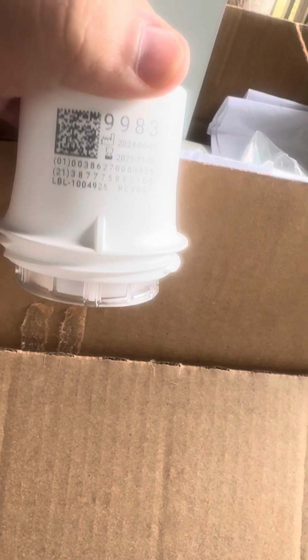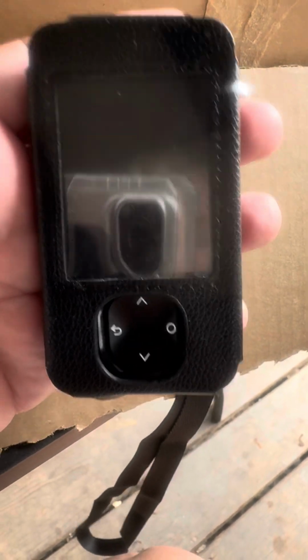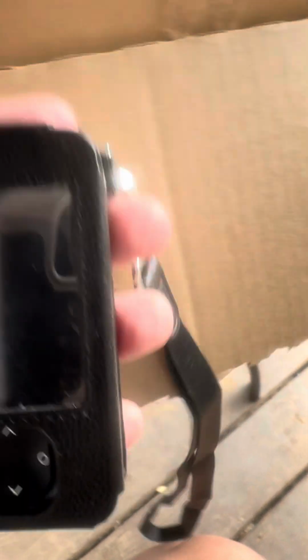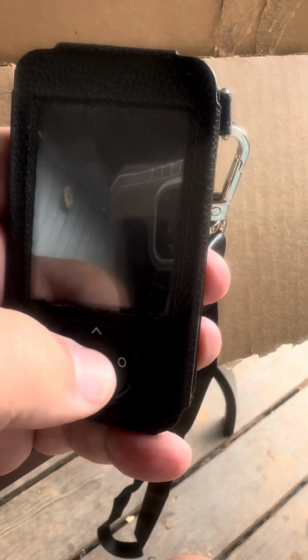Then you program this code into either the app on your phone or into the sensor reader. And then it takes about 30 minutes for your sensor reader, which I use because this thing, one charge can run it for over a week. So I absolutely love this thing. I prefer to use it over my phone because it would have to use Bluetooth to whichever device. And I already have other devices that are on my phone, so I don't want to use my phone for it. Though you have to keep this within 20 feet of you at all times.